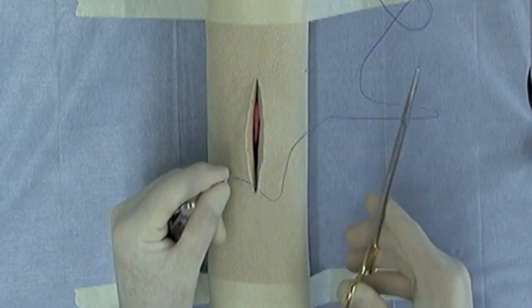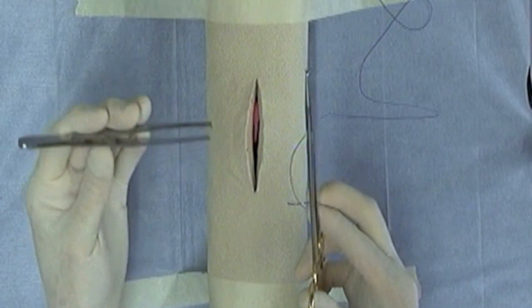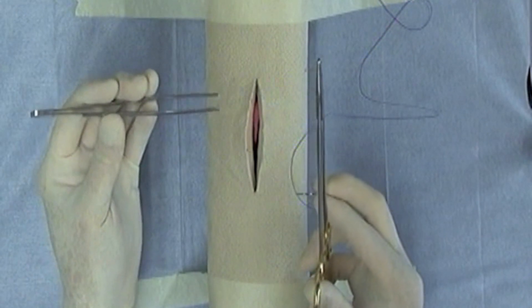We'll be using needle holders, some form of thumb forceps. This one happens to be a rat tooth forceps.